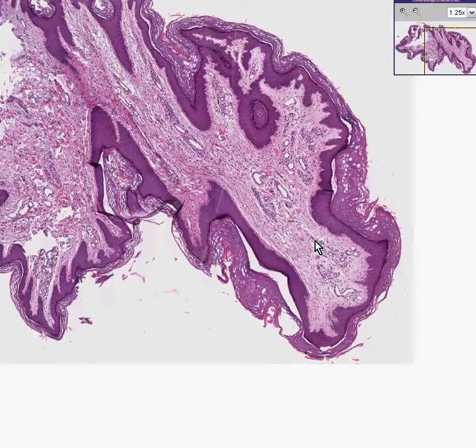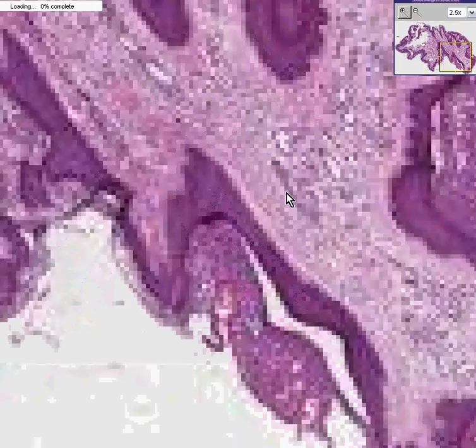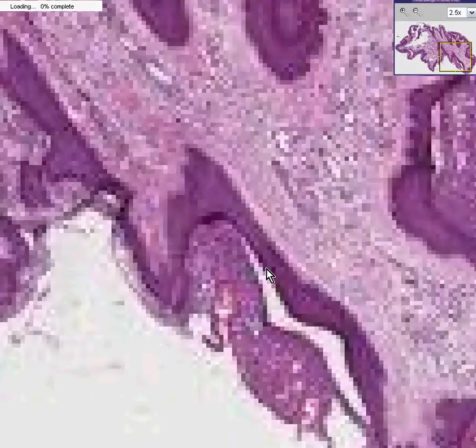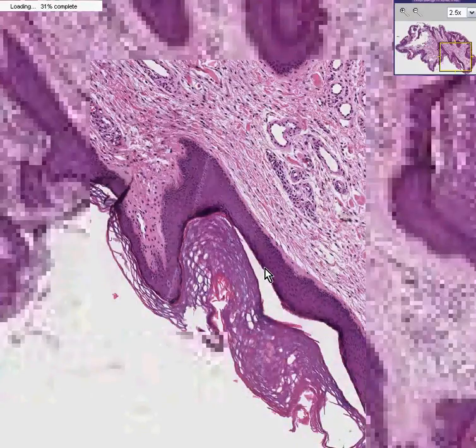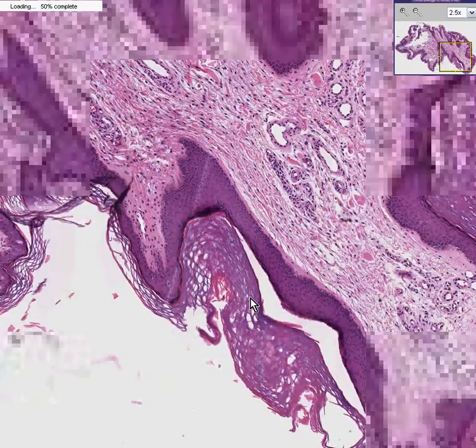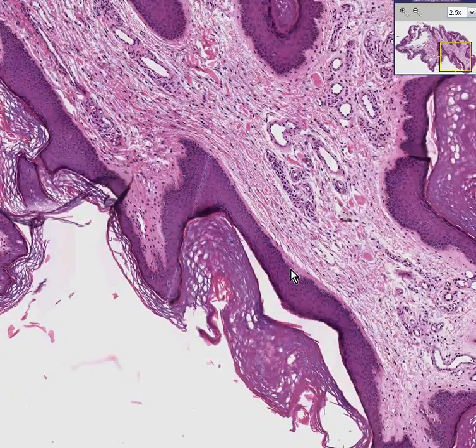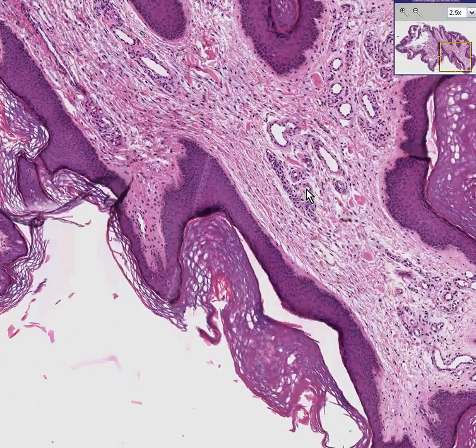It looks exactly like normal skin, except the skin appears to be growing outward as a polyp rather than flat along the surface. Here's the stratum corneum, here's the rest of the epidermal layers, here's the basal layer, and here are some blood vessels, which would normally be in the dermis if this were on the surface.